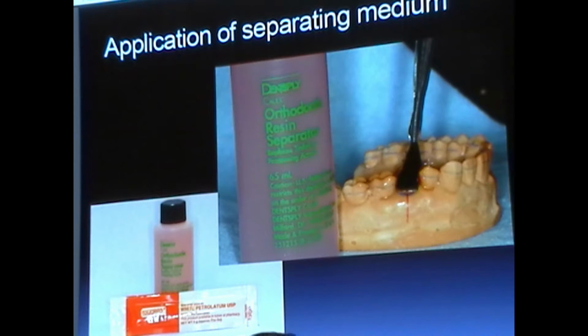But usually if you put the Vaseline down first and several coats of all coat, or the all coat first and then the Vaseline, you usually don't have issues with things sticking.